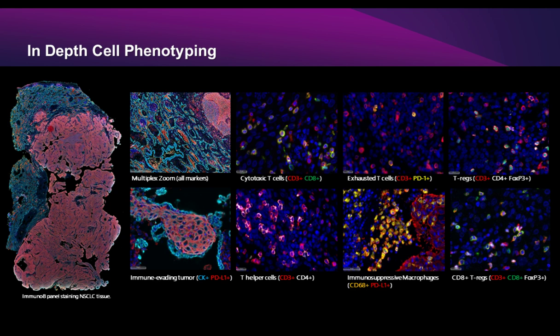Yeah, and if this is Scott, if I could just tag a little bit on that. In our experience, we don't really have too much of an issue between looking at the different spaces, particularly with FFPE sections. We've had some concern when we do fresh cells and looking at cytopreps, but in our experience with FFPE, there hasn't been an issue detecting them in multiple locations.